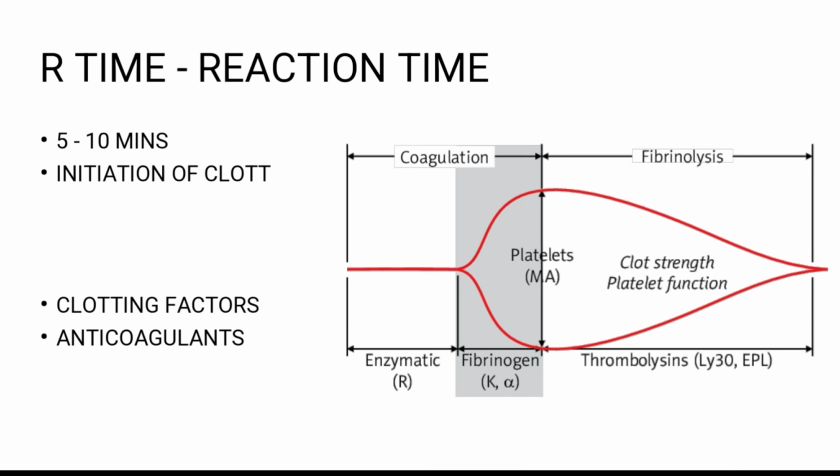Now let's talk about the parts of the graph. The first segment is the R time, or reaction time. This is this portion.